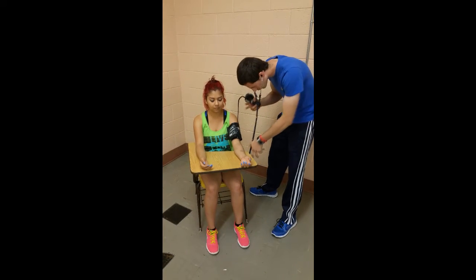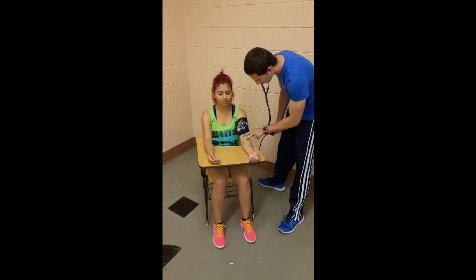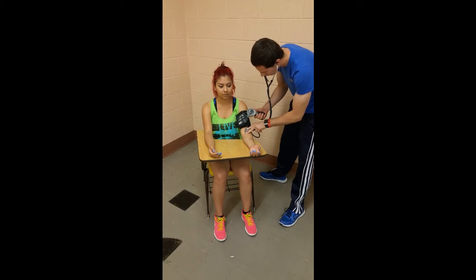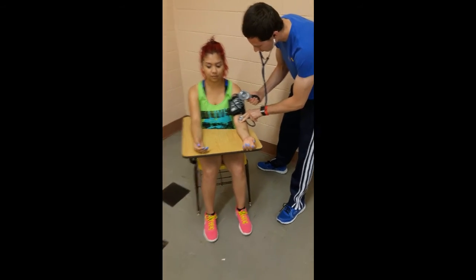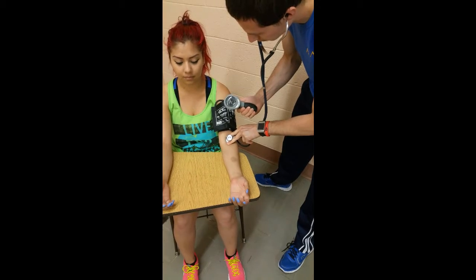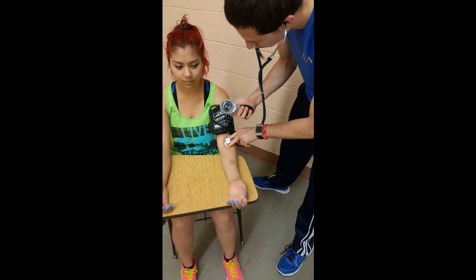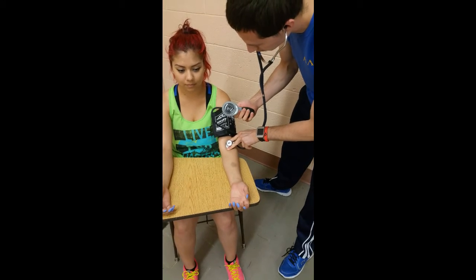be placed. What you want to do next is place the index and middle finger over the large circle of the chest piece. Place the large circle directly underneath the cuff, termed antecubital space. You can then start pumping the cuff up to 200 millimeters of mercury.